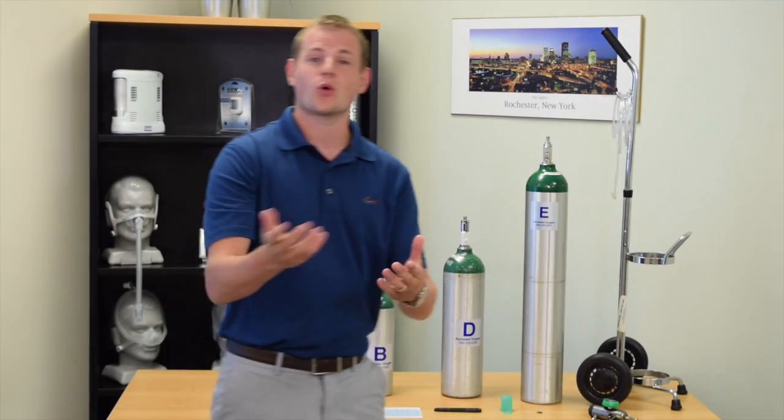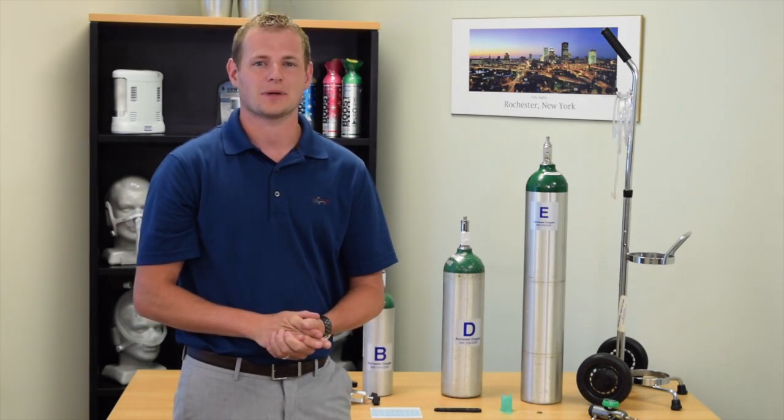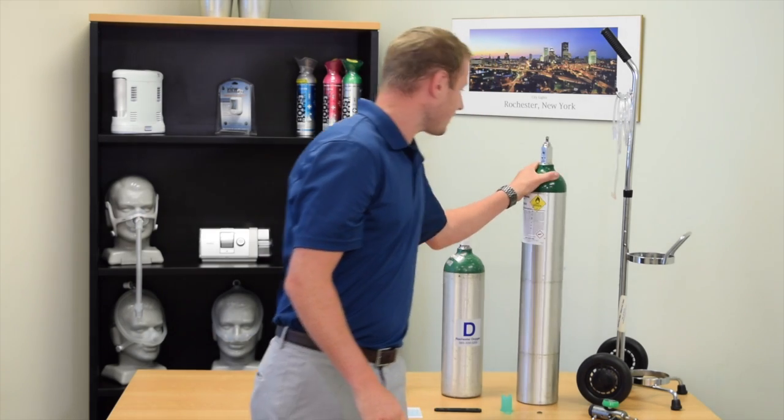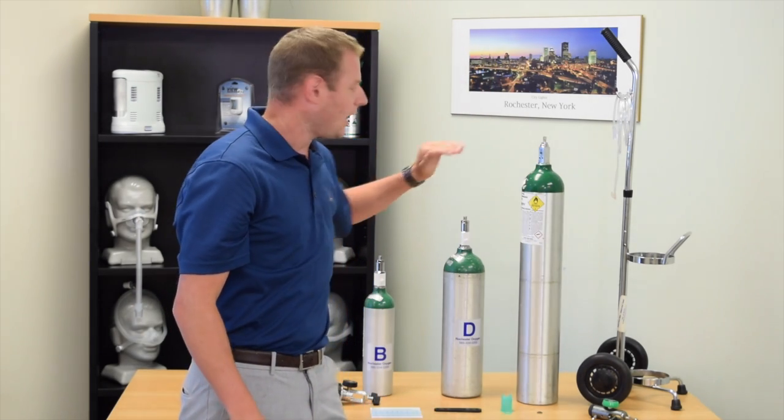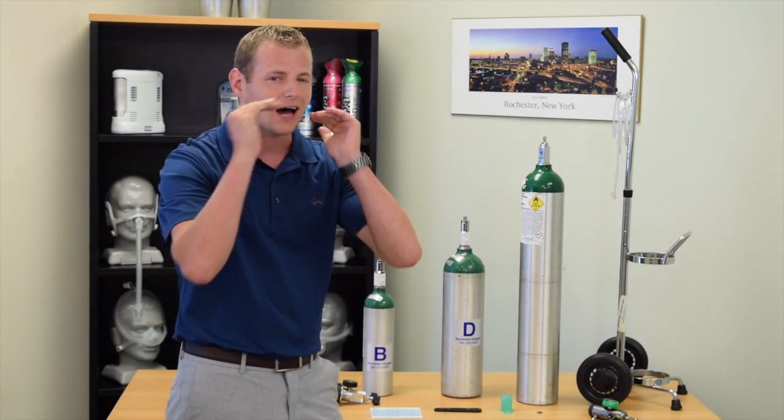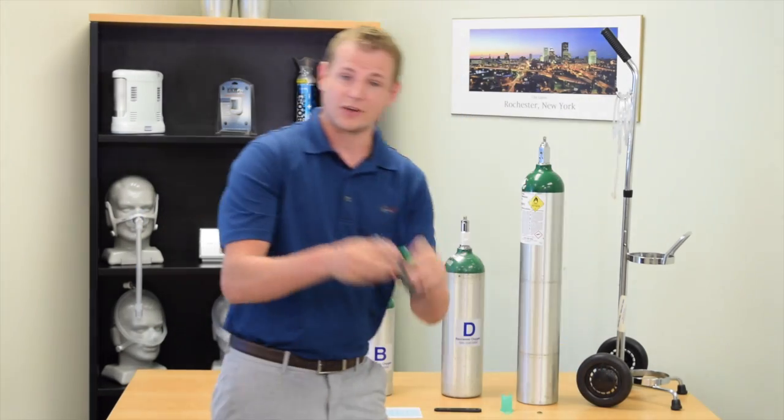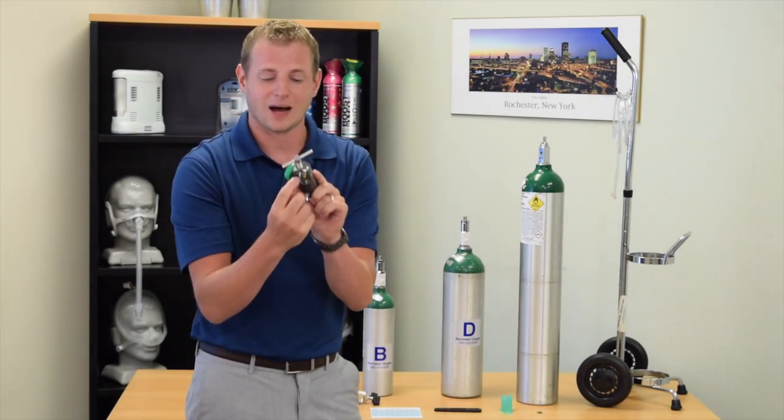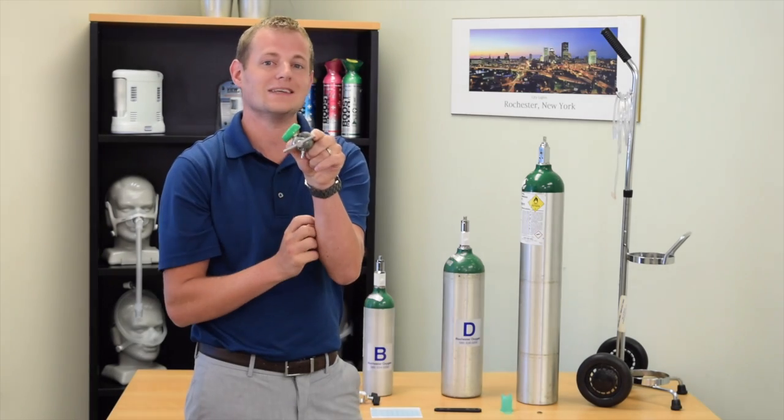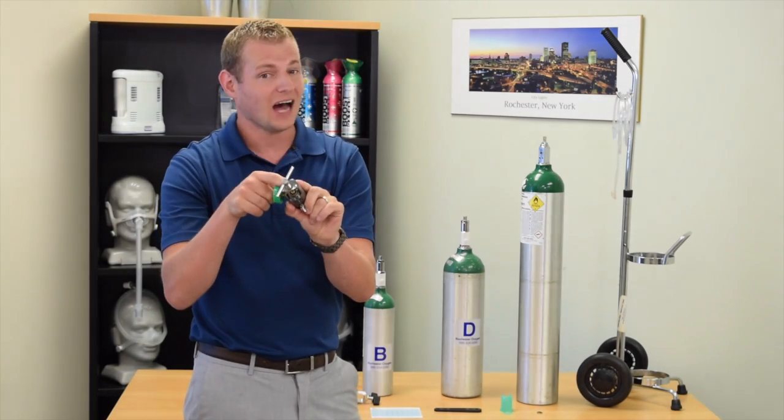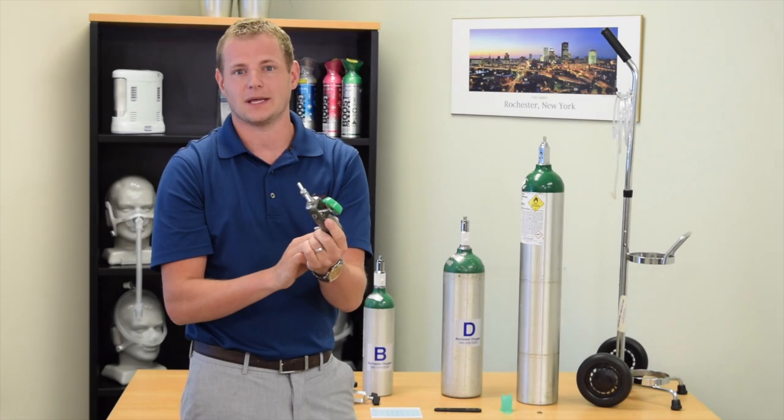Once you have all your equipment, it's time to set things up. Start by placing your tank on a flat solid surface. Eye level is usually preferred as it allows you to see a little bit easier. Grab your tank regulator and verify that your copper washer is in place. If it's not there, grab an extra washer and pop it in.